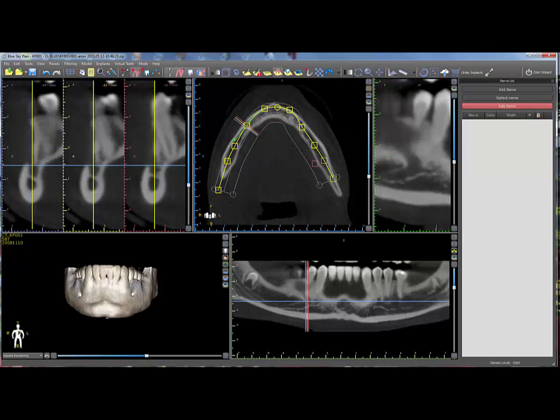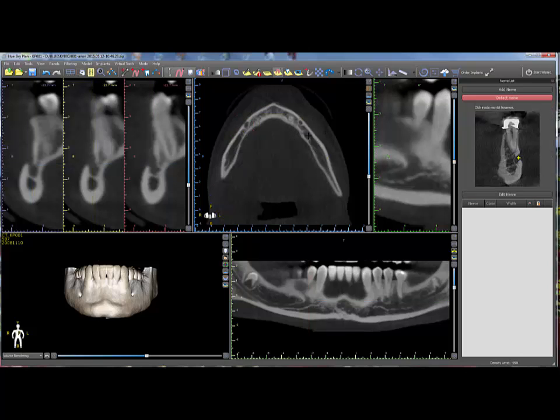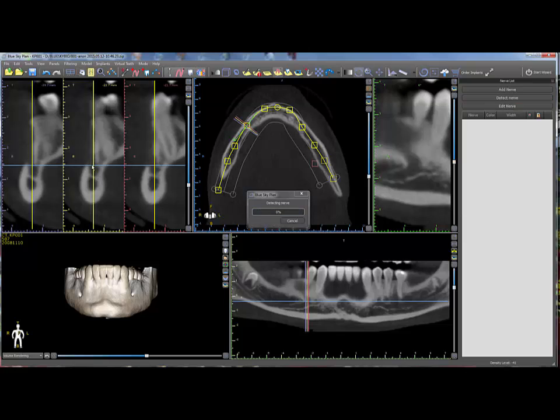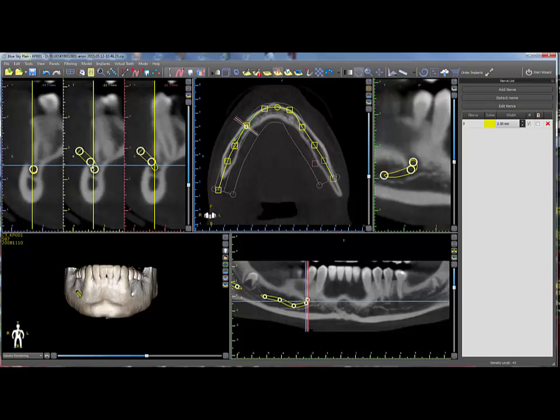Click on the detect nerve button, and in the cross section view click on the entrance of the mental foramen, and Blue Sky Plan will draw the nerve.